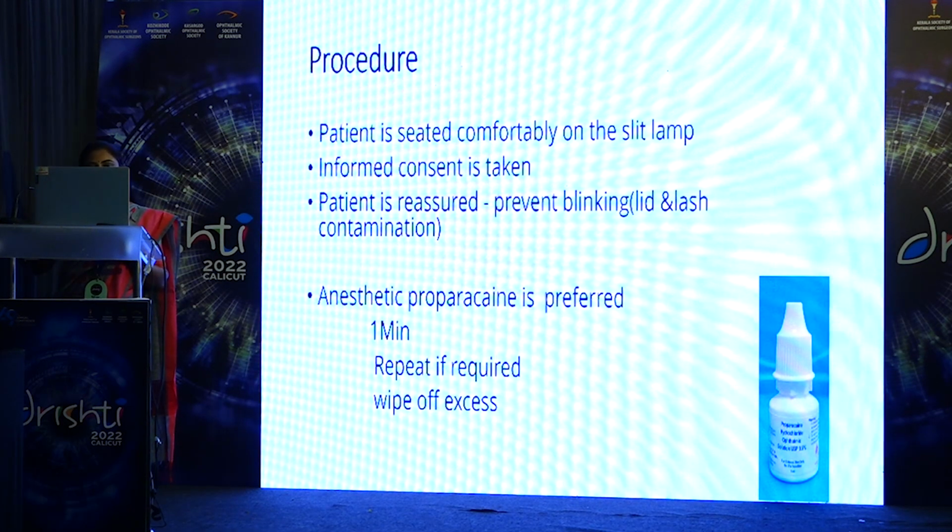Now, the procedure. Most important thing is to inform the patient regarding the procedure so that the patient is comfortable, and take an informed consent. Once the patient is reassured, it will ease the procedure, and the patient won't blink, because blinking is one reason which causes contamination of the scrapings from the lid or the lashes. So the local anesthetic proparacaine is preferred because it is the least microbicidal one, and you can wait for some time, ideally 1 minute, and you can repeat the topical anesthetic if required. But we always have to remove the excess anesthetic that is there in the conjunctival sac prior to this.